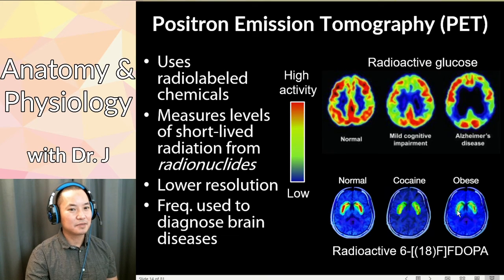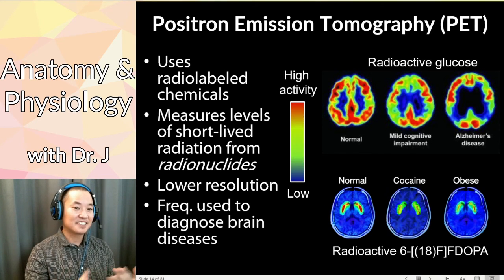Yeah, so you don't see as much red. So this is the other thing too. You see impaired dopamine signals in this scan of an obese person's brain. So yes, food addiction is real because, again, addiction, pleasure and reward all involve dopamine.